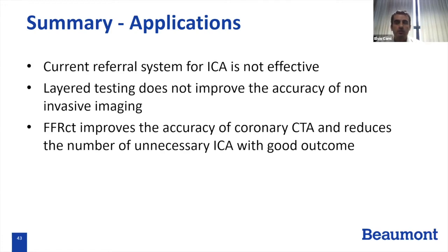Now, sometimes as the reader, I'm not a fan of that protocol that much. It's not bad, it's good, but sometimes what I'll do is a retrospective study instead, and then use a window of like 30% to 90%, meaning the current is up all the way from 30 to 90%, and between 90% and 30%, we turn the current down to save on radiation. So we use min dose outside of that window.